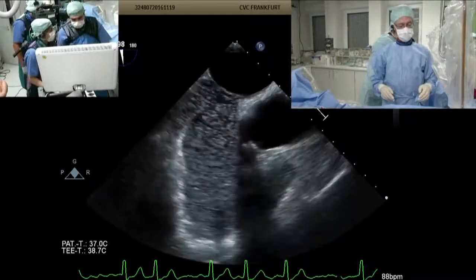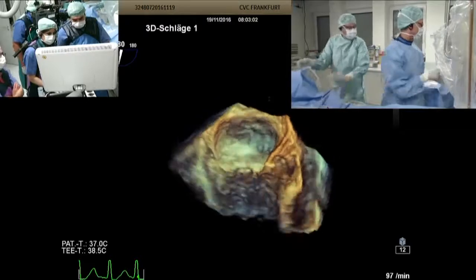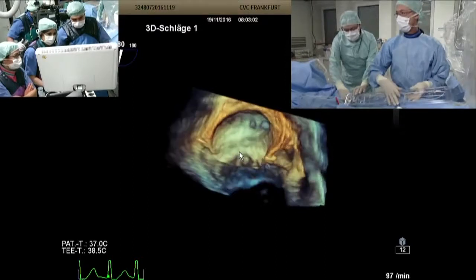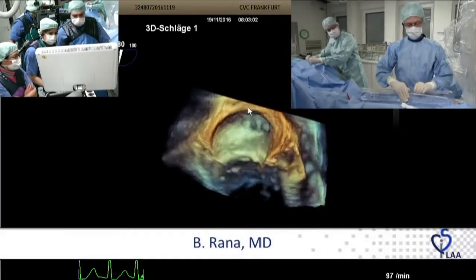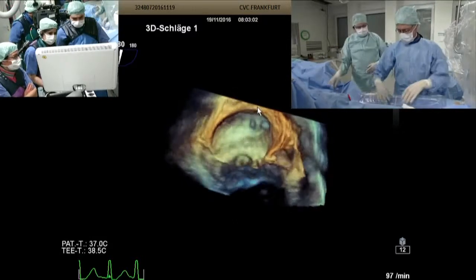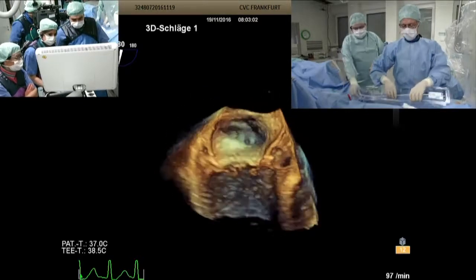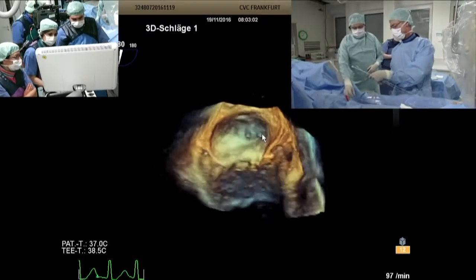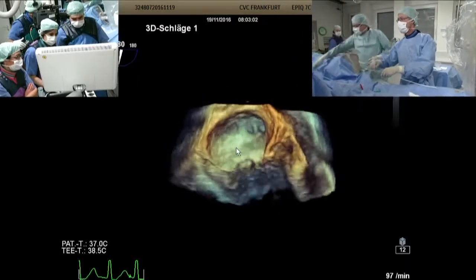Okay, so should we just start with the 3D, then we'll go through the systematic 2D images. So here's our 3D picture. Just to give you some landmarks, this is the edge of the mitral annulus. Here's the orifice of the appendage. And this top superior surface here is your Coumadin or warfarin ridge. You can see it spirals down. And interestingly, it looks very shallow, this appendage. Before that, there aren't obviously any deep lobes, just looking at the 3D.